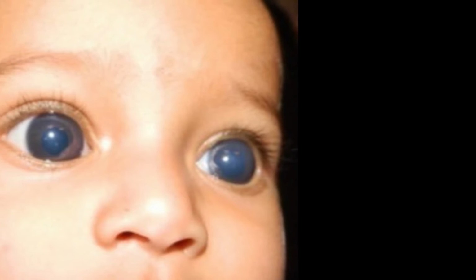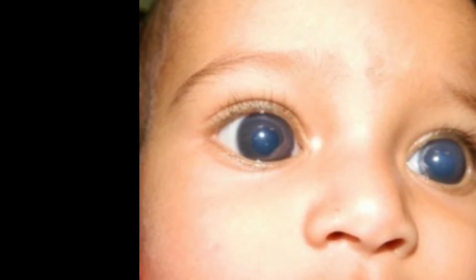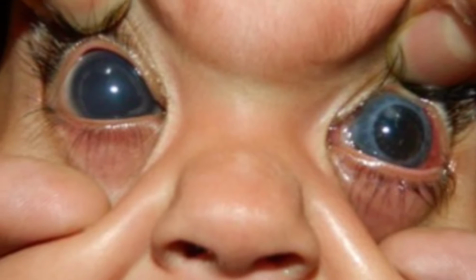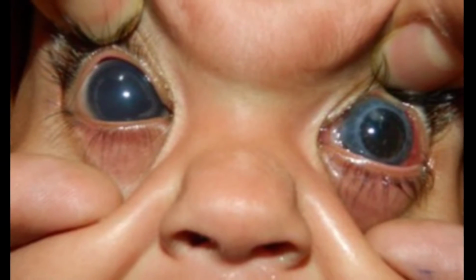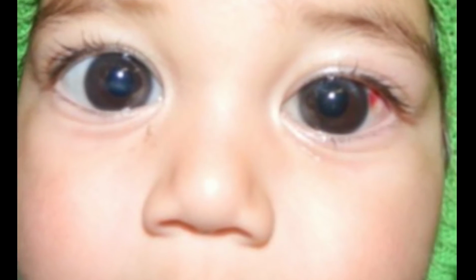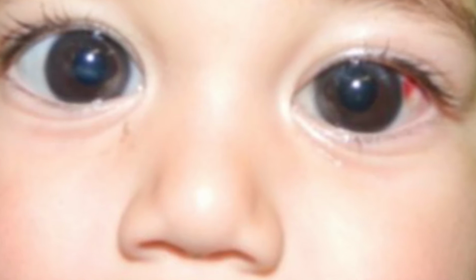However, the story does not always have a happy ending. A sizable number of these eyes end up undergoing multiple surgical procedures for the control of intraocular pressure and corneal opacification, which leads to development of cataract in these eyes. Handling cataract in a buphthalmic eye offers many inherent challenges.